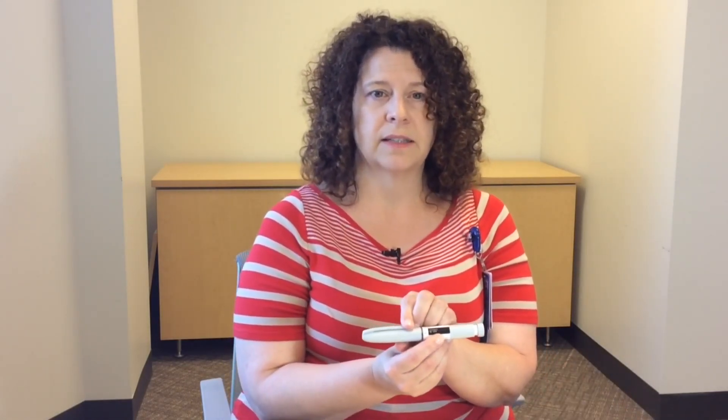Make sure your insulin pens do not freeze. You can store the unopened pens in the refrigerator until ready for use, until the expiration date printed on the pen, which you'll find in the black box, has expired.